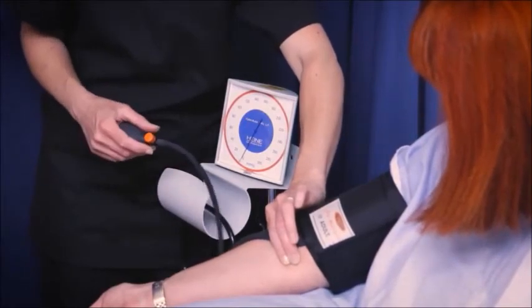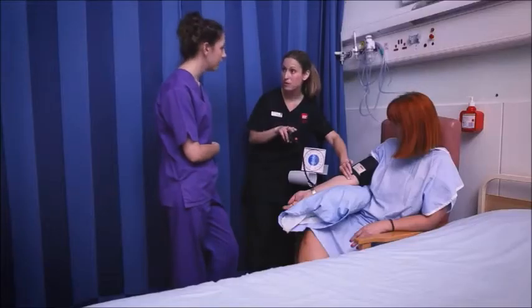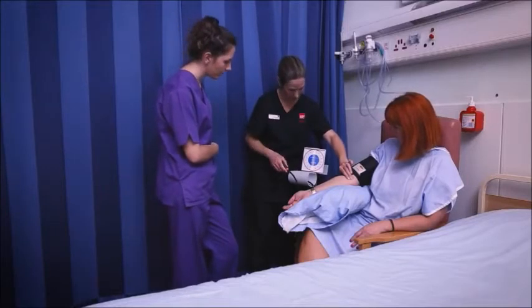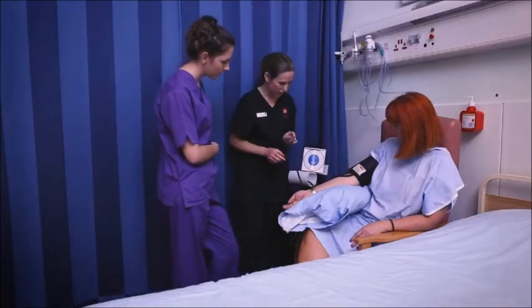So that's now my estimated systolic reading. If you remember, it's got the two metrics, systolic and diastolic. So that's the estimated systolic reading.